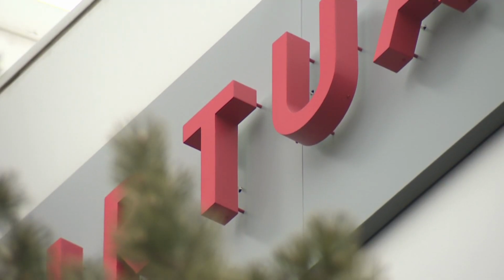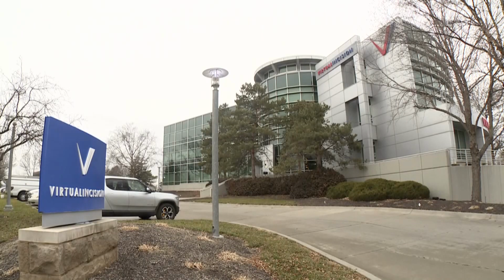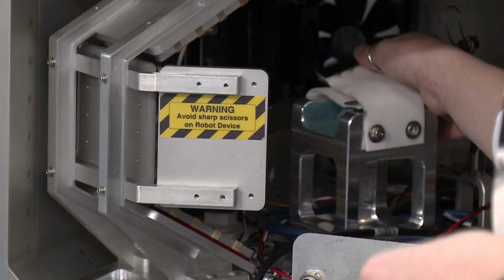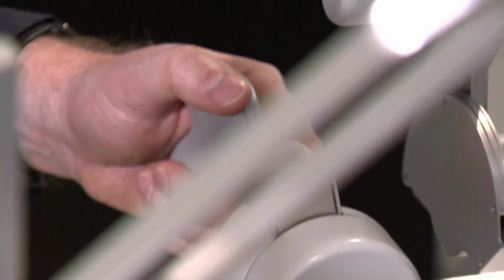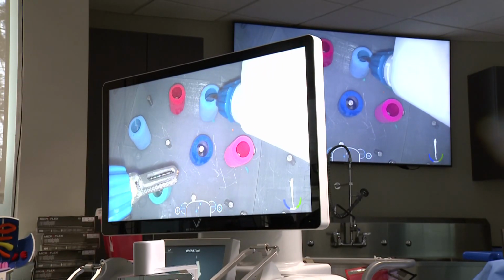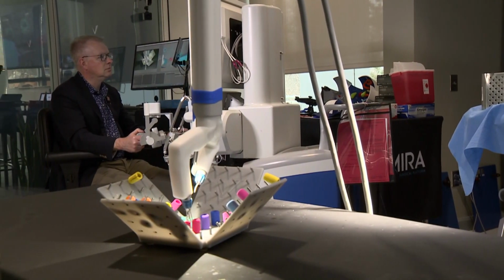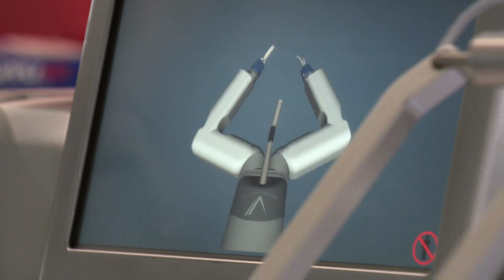When it comes time to test, a surgeon in Lincoln will head to the headquarters of Virtual Incision in Lincoln to control the robot 250 miles above Earth. Inside the experiment locker, the left arm grasps. The right cuts what is a simulated surgical tissue. Of course, there will be time delays between ground and space. Plus, how will microgravity affect the experiment and the surgeon? Encouraging results could pave the way for surgery anywhere and a surgeon somewhere else.